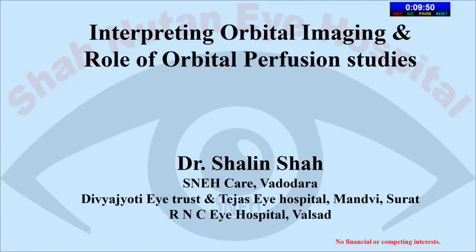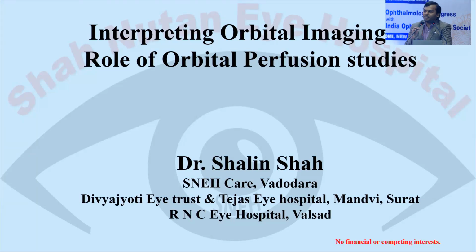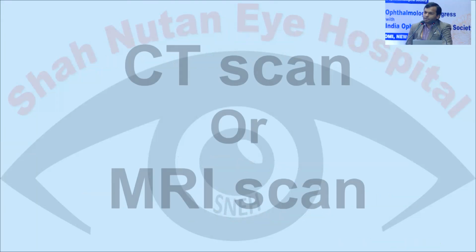So, ma'am has given us a very comprehensive view of how to remove the tumors. Now, I'll just brush upon this. Sometimes we need to look at the DICOM images ourselves before planning the surgery. Often the diagnosis given by the radiologist may differ from our clinical diagnosis. At this point of time, we need to have our own DICOM app in our laptops and go ahead and interpret the images.